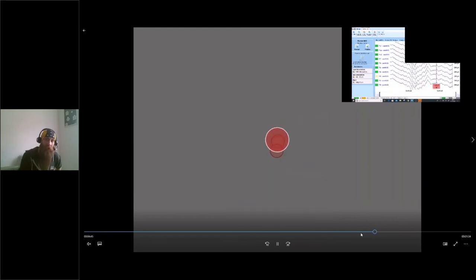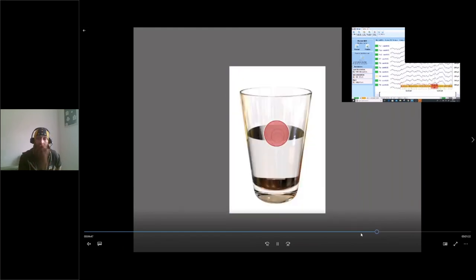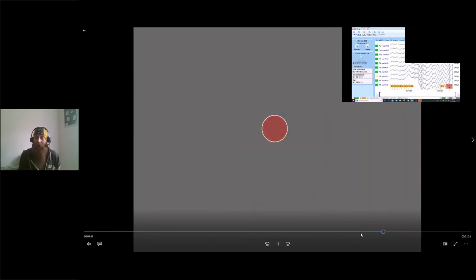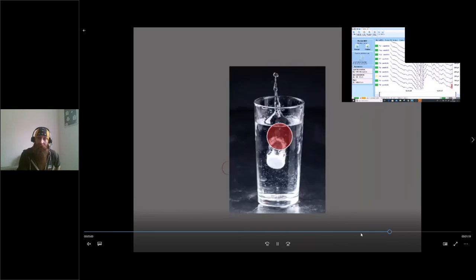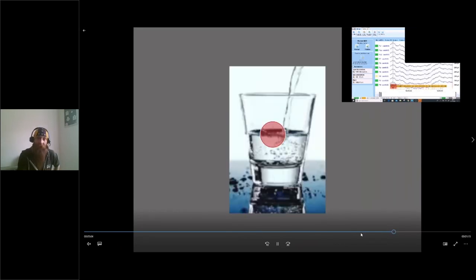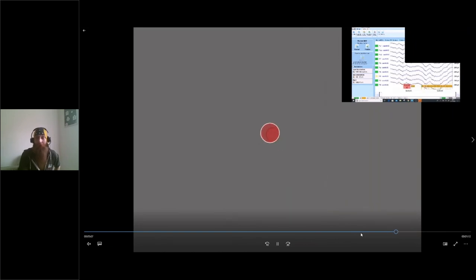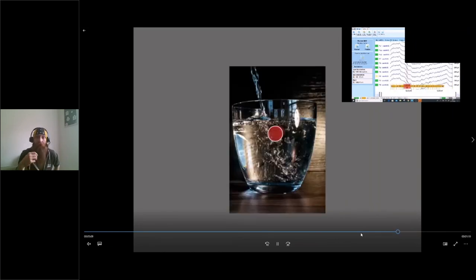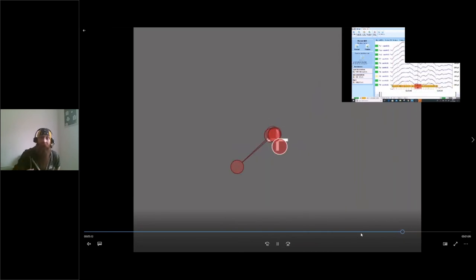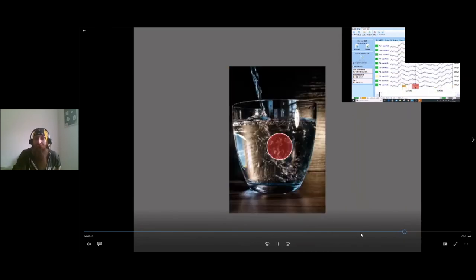You will have to excuse that they're a little out of time. That is due to my video editing skills, not the systems not being in time. But you should be able to see that we obviously get a C1 marker, as it is on this particular instance, that represents our fixation. We get a number of markers representing the presentation of each of the images. And hopefully you'll be able to see as well that the progression here is only happening when the gaze is on the fixation cross.